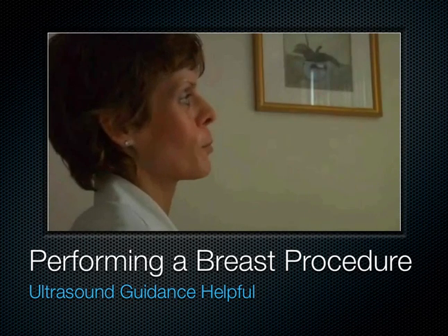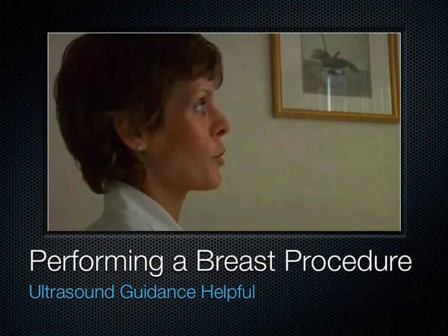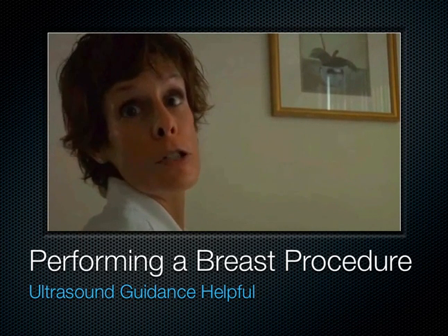As you can see, you have to have the probe centered directly in the middle of the lesion. This is not something you can just do by palpation or just by feel.